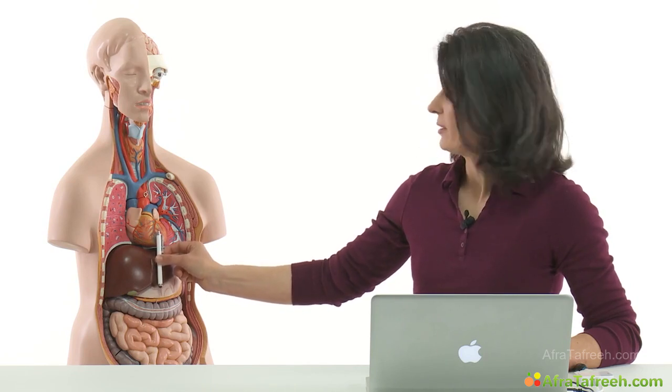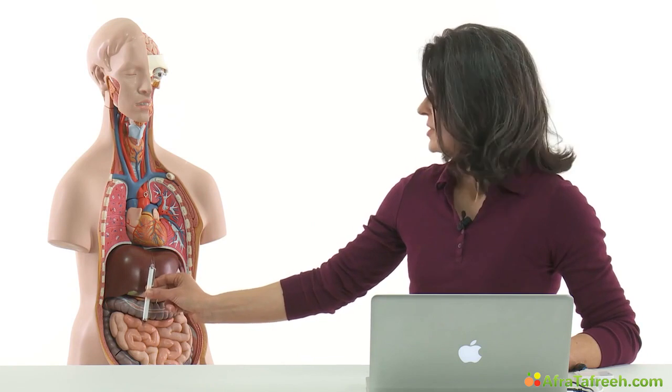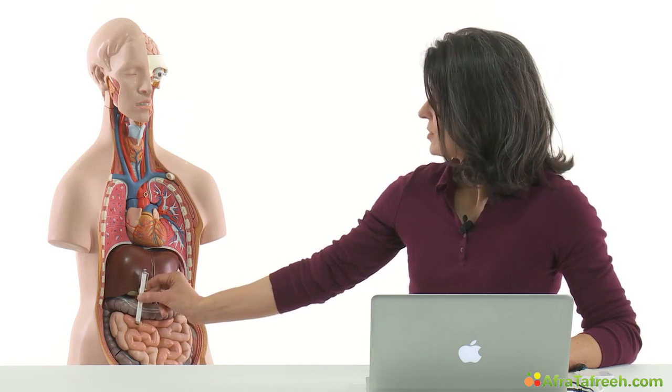Here we can get a good look at the left liver lobe. The second view is also longitudinal, but this time below the costal margin, below the costal arch. This is our longitudinal subcostal view.